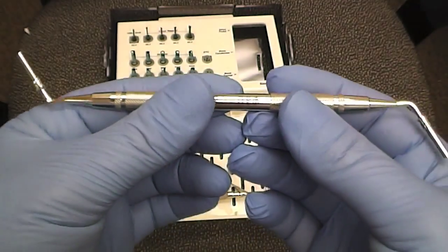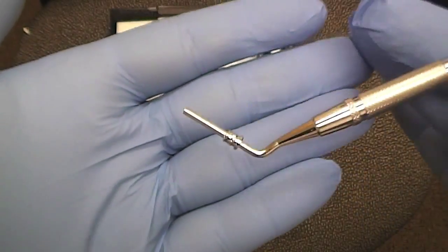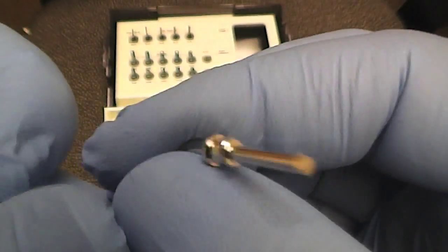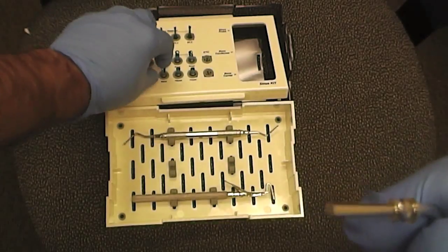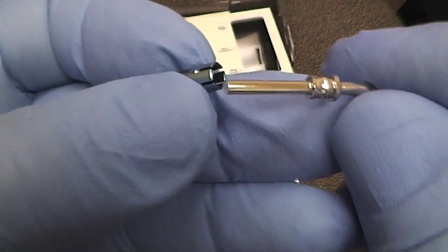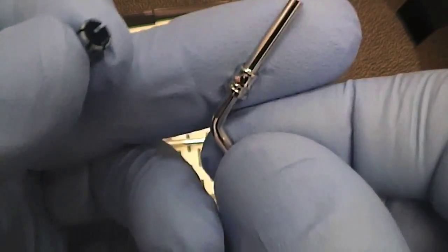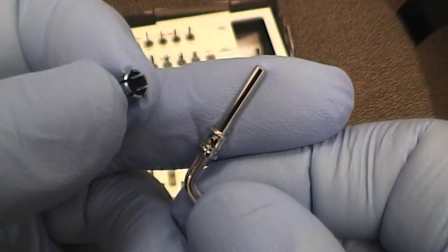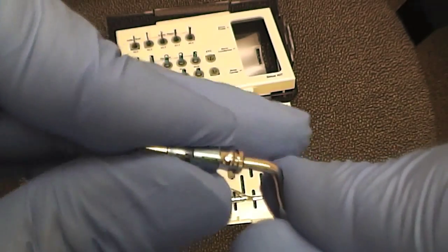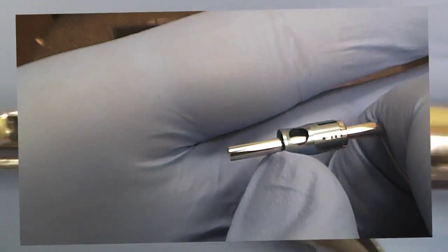The next one I'd like to talk about is actually quite important. It's the bone compactor. It also has two sides. One is 3 millimeters and one is 2.2. You'll notice it also has a stopper mechanism on it. And this is actually quite important because one of the major ways that people end up perforating is when they are applying the condenser into the osteotomy. It slips and suddenly forces its way very, very quickly, full length, into the sinus, and then the edges will perforate the sinus. By using a stopper on it, they create a stop form so that it's a safety.